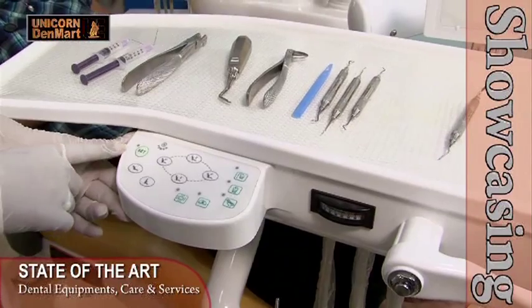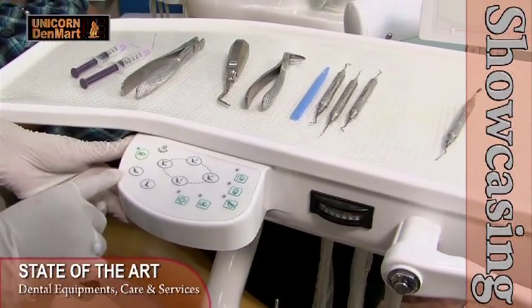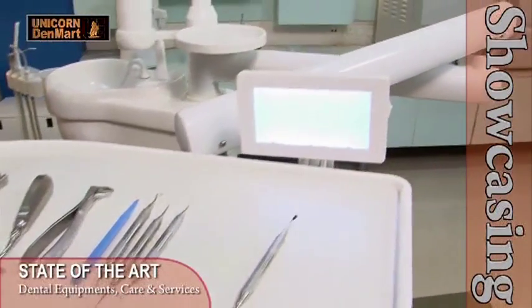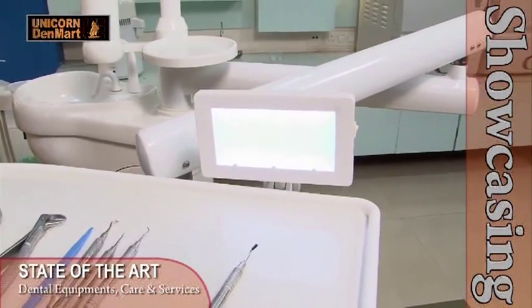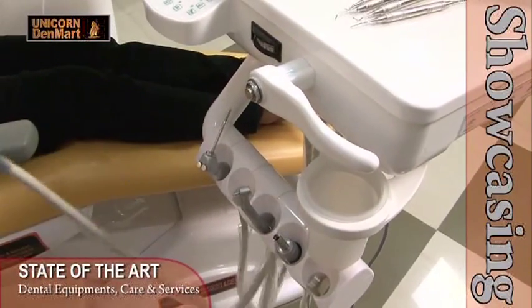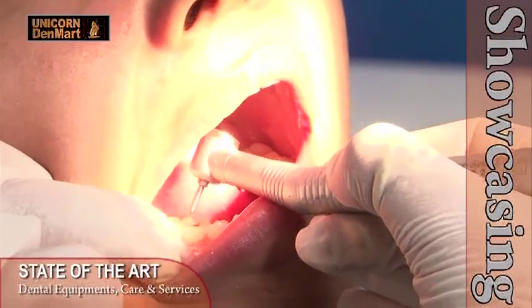With an LED X-ray Viewer, Planet Dental Chair allows the user increased and clear visibility of X-ray film during dental treatments. This unit consists of a terminal for a three-way syringe, two high-speed air rotor terminals and one air motor terminal.